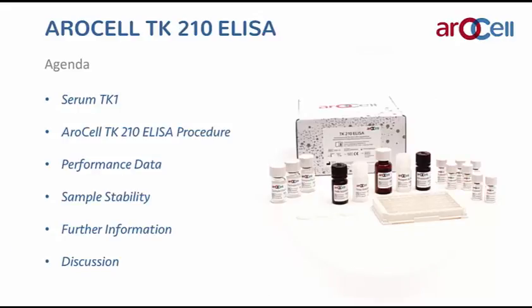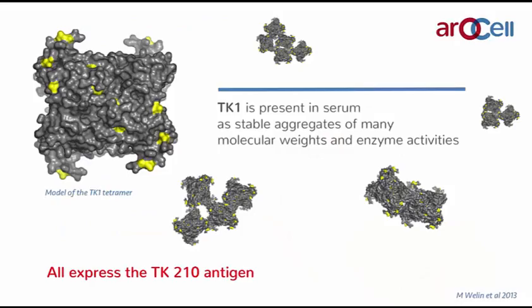First, a bit more about TK1. I'll repeat the points that are important from an analytical point of view, and then the assay procedure, performance data, sample stability, some further information, and then discussion.